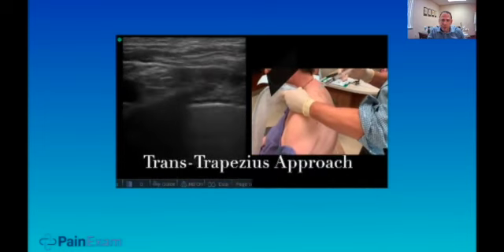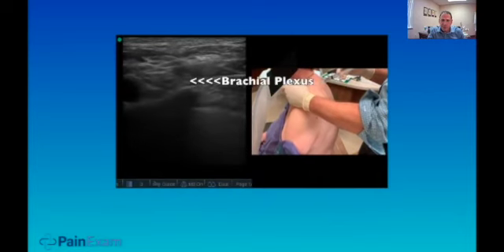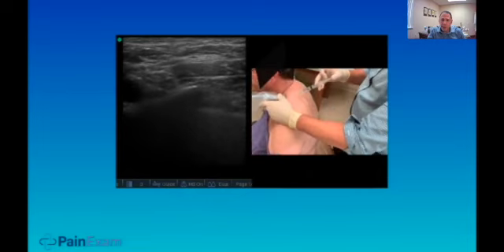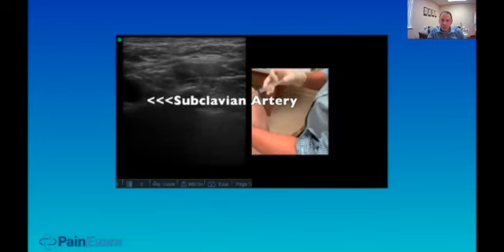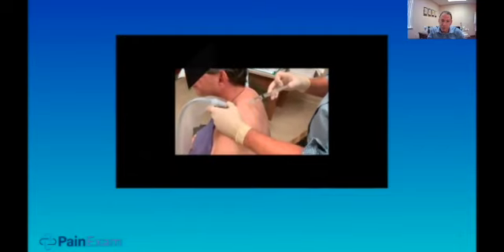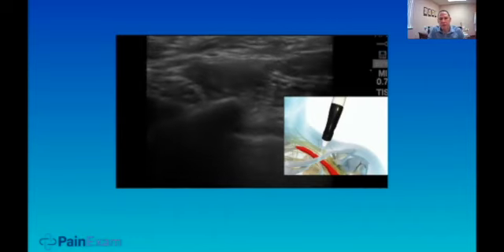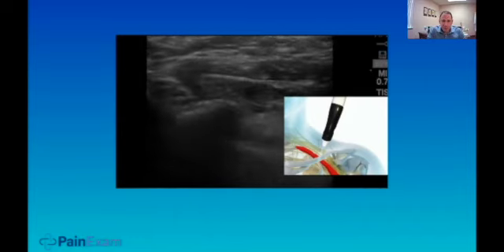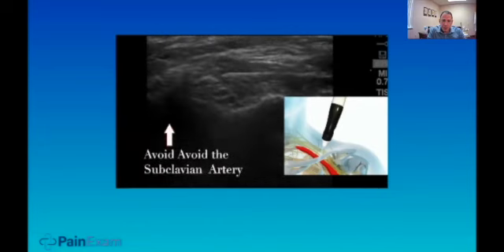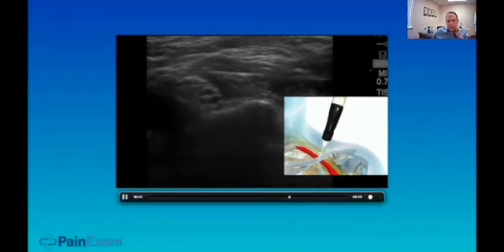Here I'm giving about 3 or 4 mLs of dilute bupivacaine to anesthetize him for a shoulder bone marrow aspirate procedure. So this is like I'm giving regional anesthesia here. This is not really a pain block. I'm doing it for regional anesthesia because this surgical procedure is actually an injection of bone marrow aspirate into his shoulder. But I don't need large volumes here. So I'm giving him the 0.25% bupivacaine, and you could see when I'm approaching from behind like this, I'm not aiming at his lung. His lung is down here.